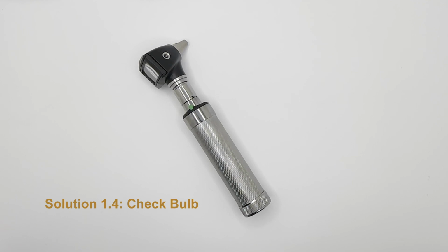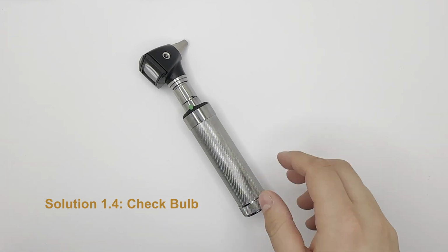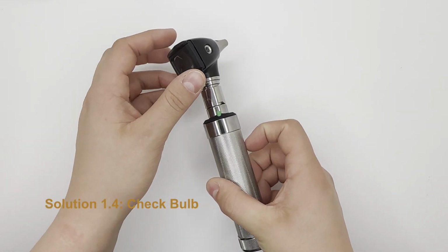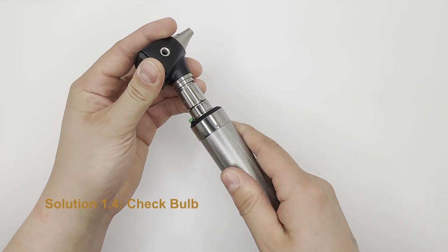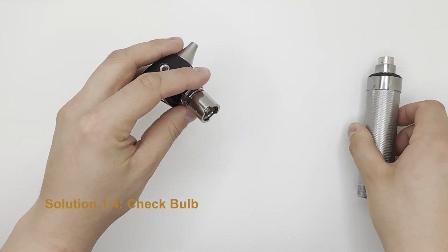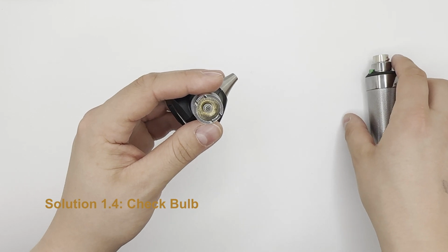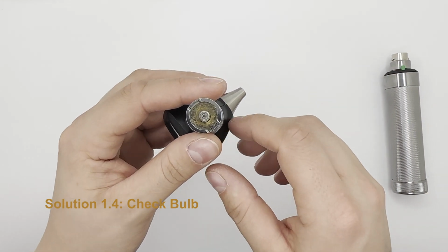If the battery is in good condition and appears to be capable of holding a charge, and the bottom cap spring is in place, it is possible that there is a problem with the light bulb. Remove the head of the scope from the handle. This involves rotating the head counterclockwise as viewed from above until the notch within the handle can spring free and the head can pop off.